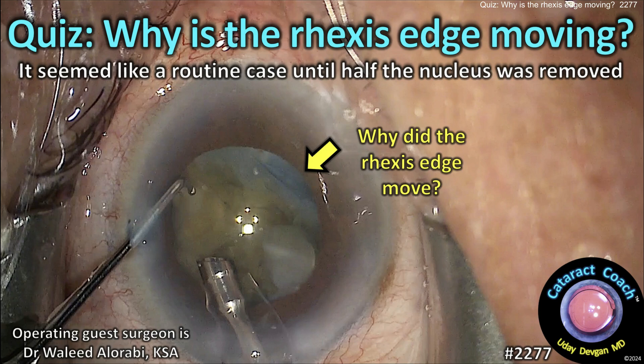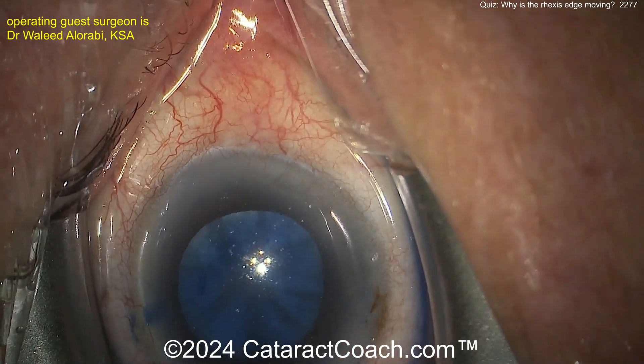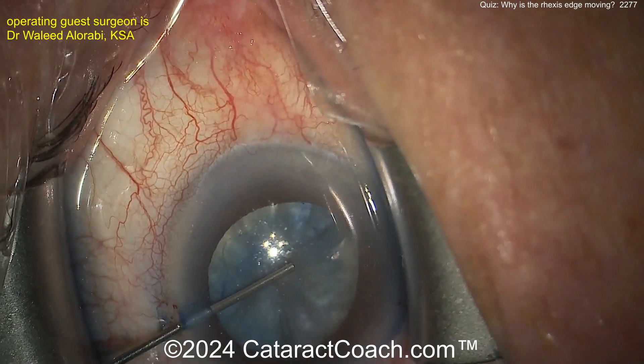Welcome to cataractcoach.com cataract quiz. Why is the rhexis edge moving? It seemed like a routine case until half the nucleus was removed. Let's watch — trypan blue dye is already in, here comes the viscoelastic.